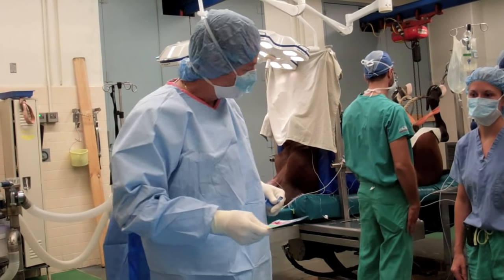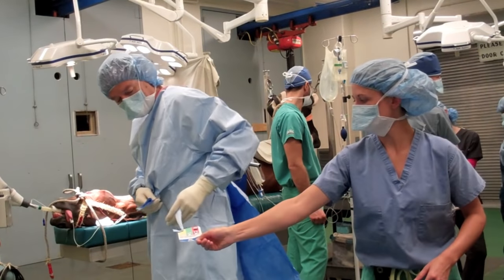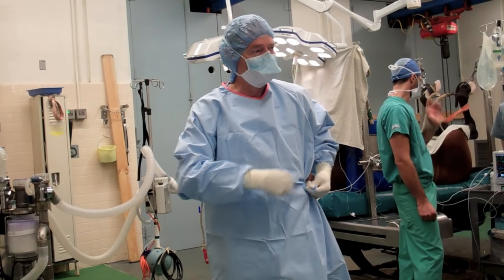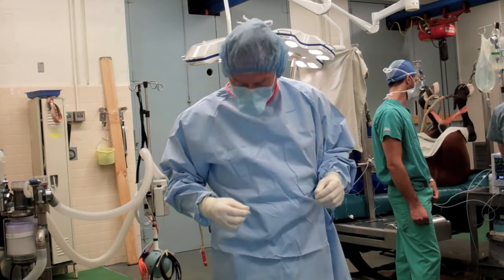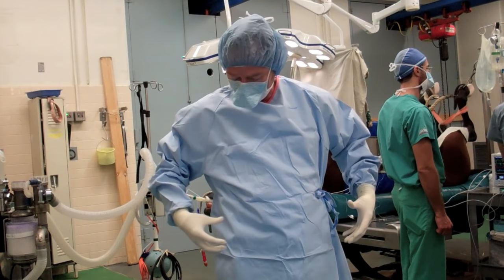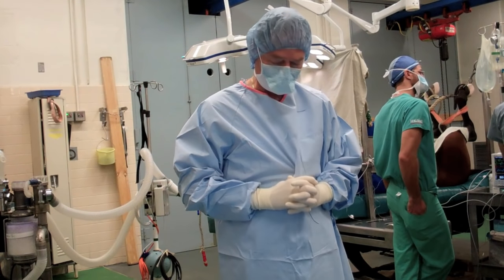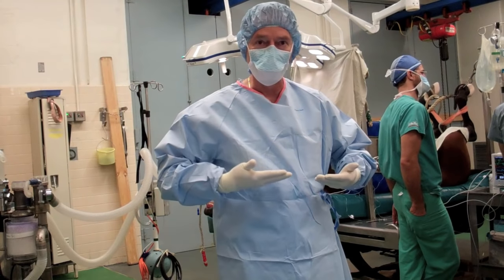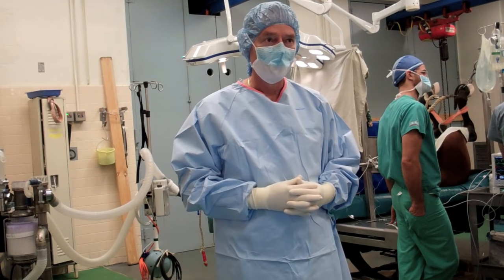I'm going to use this sterile tie, and this way, theoretically, my back is sterile. However, you never want to count on the fact that your back is sterile. Anything from about belt height to mid-chest is considered sterile — nothing above, nothing below, nothing behind, even though we have a sterile back gown. If I'm waiting during surgery, I'll cross my hands and sometimes grab my gown to take a little weight off.